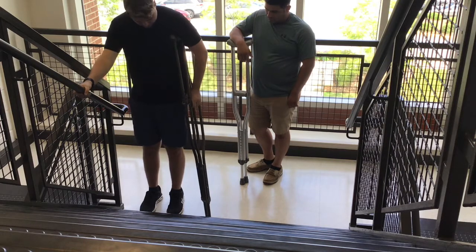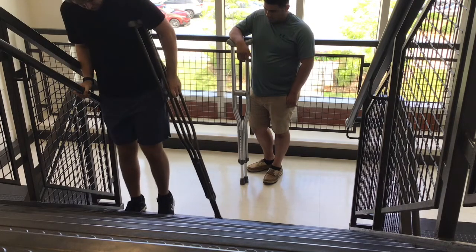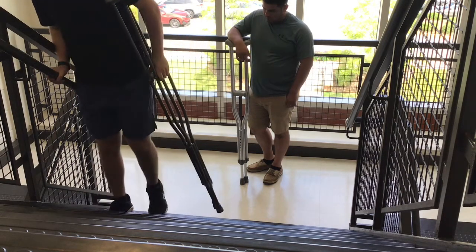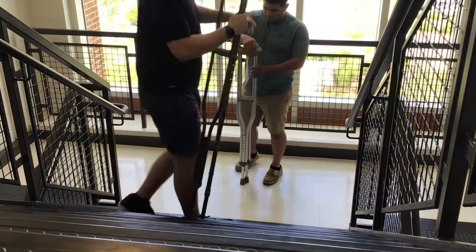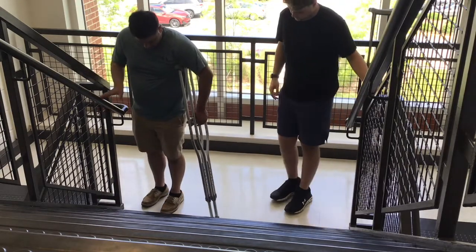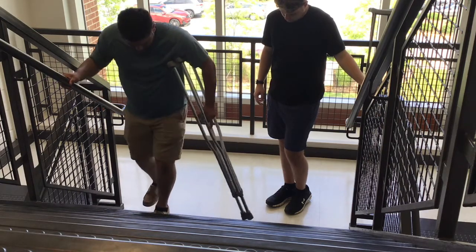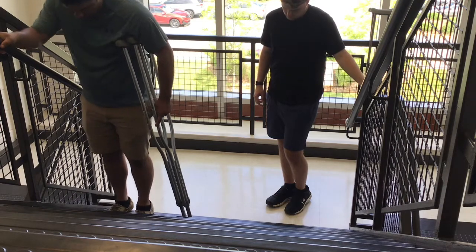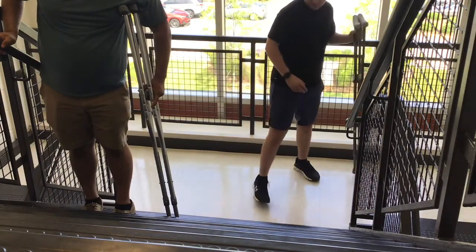So what you'll do is you'll grab onto the rail, have your crutches down by your side, and then non-injured foot, and then push up and plant the injured leg at the same time you plant the crutches. Okay, so non-injured, push up, and plant. Do that for about 3 or 4 steps for me. Okay? Alright, then we're gonna have you come back down.